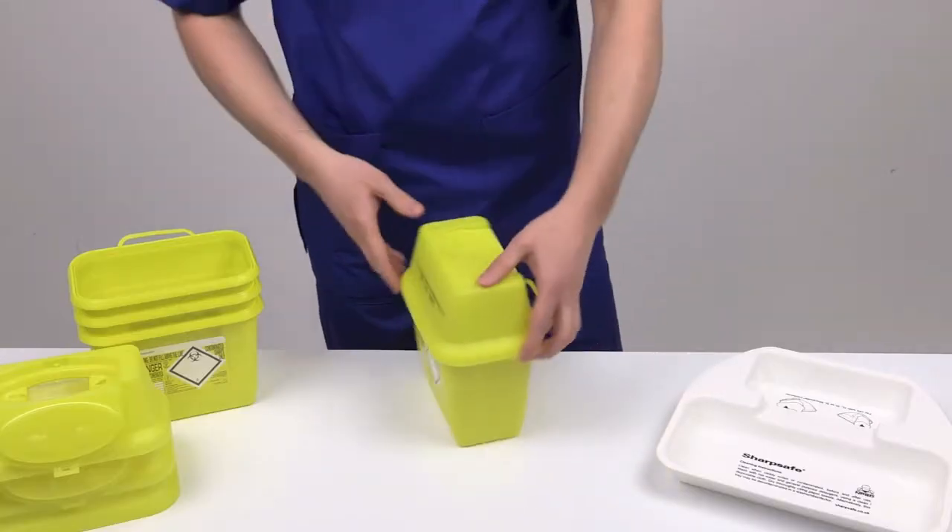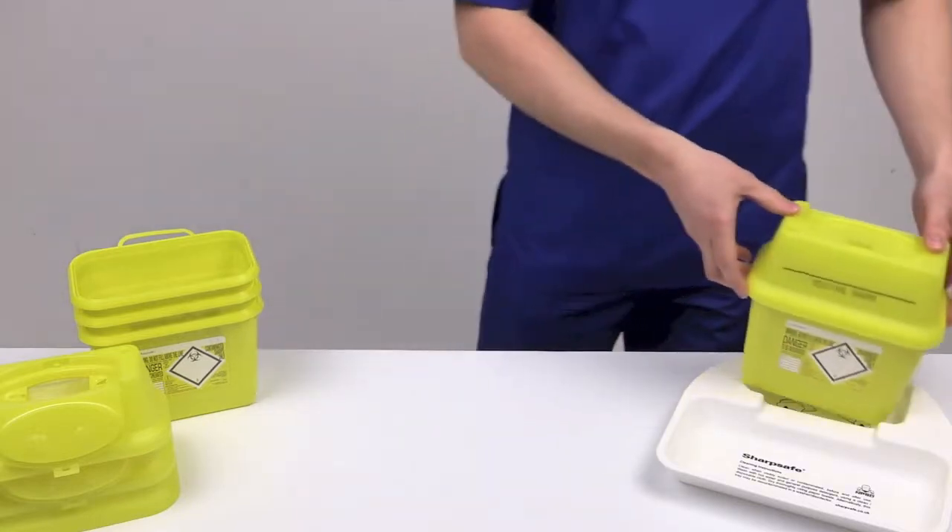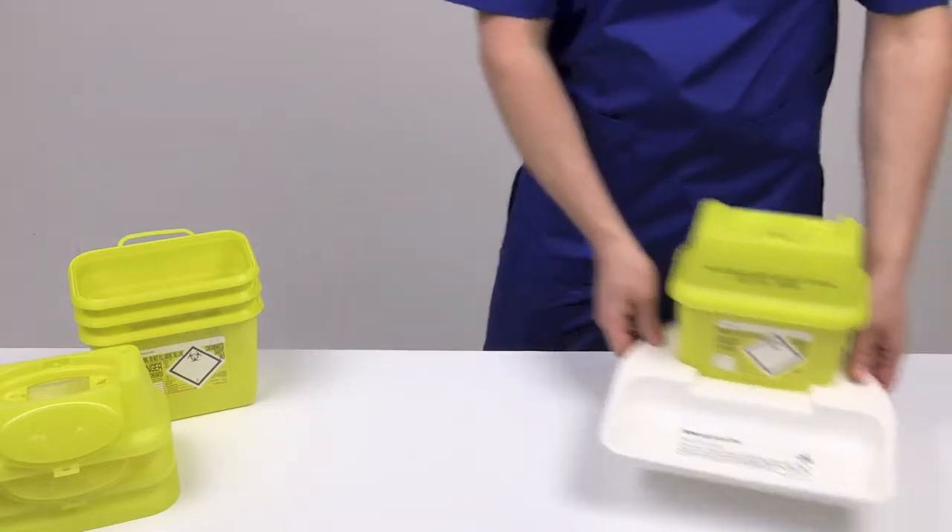The SharpSafe container can now be placed into a near-patient sharps disposal tray, ready for use.